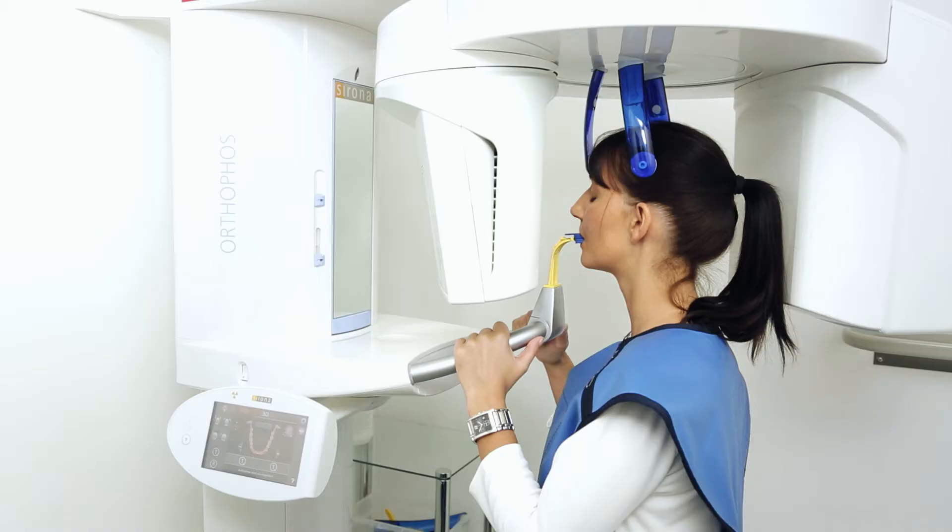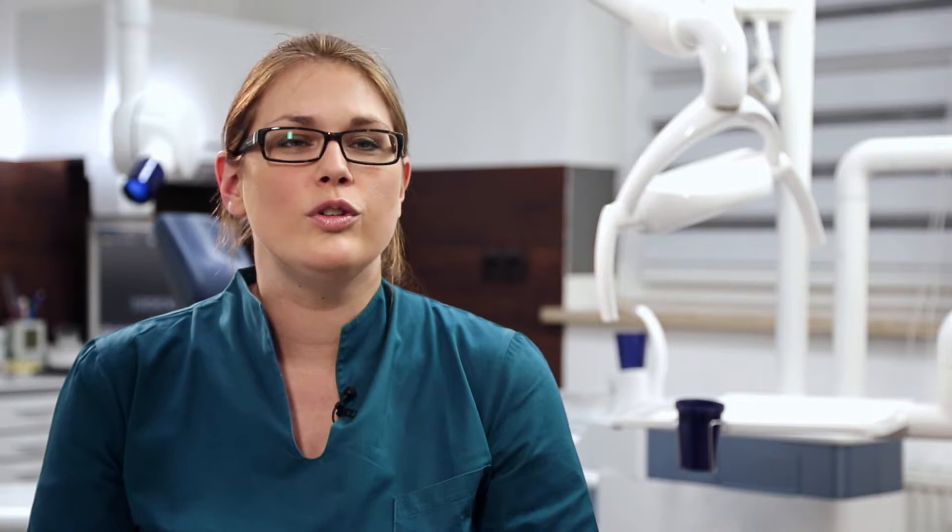We were already using the Orthofis XG3D in our practice. Changing over to the Orthofis SL was incredibly easy for the dentists and assistants. All of the functions we like best are still there, and the new system is even easier to operate.